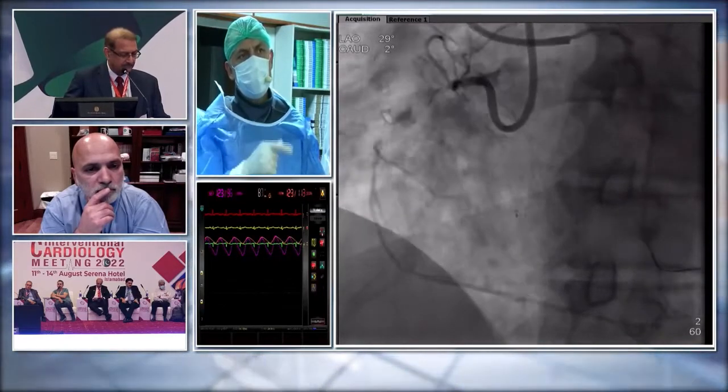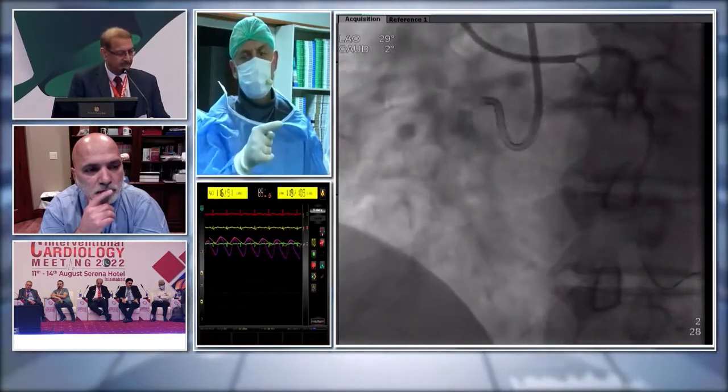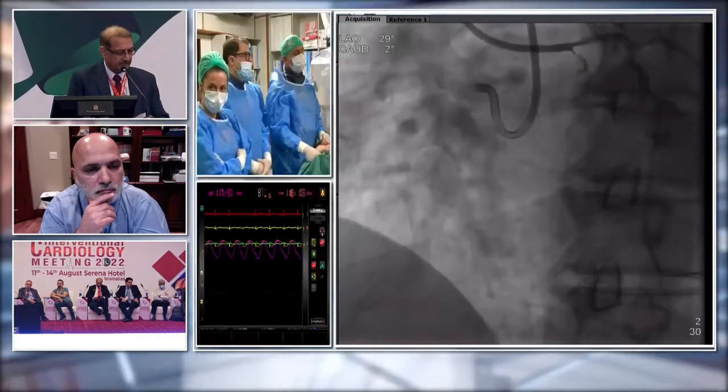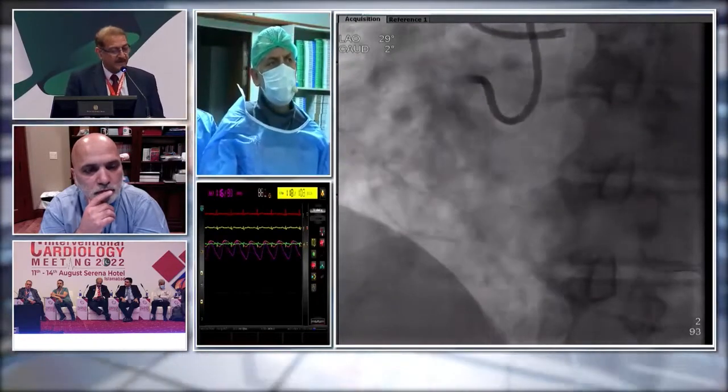In that case, we can think about cross septals rather than this epicardial collateral, because if we use epicardial collateral, patients may have pain during the procedure. We don't want that. And septals would be safer for us.